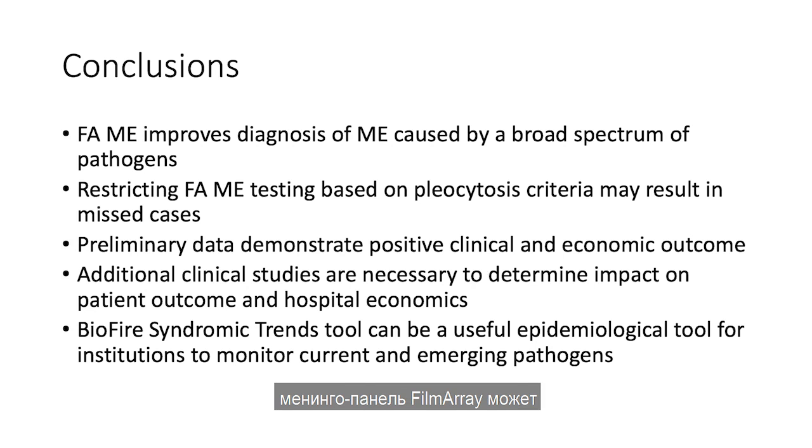So in conclusion, the FilmArray ME panel can improve diagnosis of meningitis and encephalitis caused by a broad spectrum of pathogens. Restricting the panel based on pleocytosis criteria may miss a variety of true positive cases of infection. Preliminary data demonstrate that there is positive clinical and economic outcome. However, additional studies are necessary to really determine the impact on patients and hospital economics using these types of rapid diagnostics.